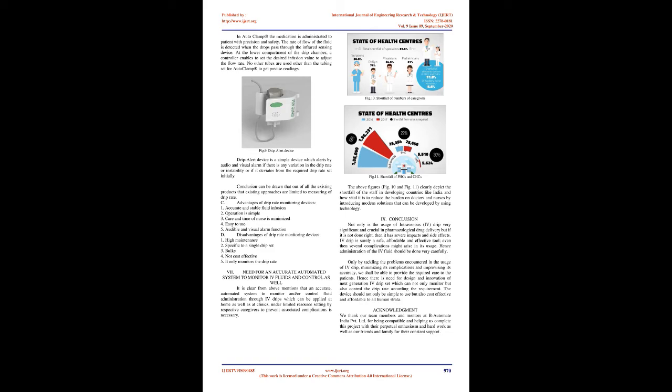Attempts made to overcome the drawbacks. Attempts were made to overcome the challenges with adaptation of drips. A few are discussed below. The traditional method of infusion was replaced by using embedded system technology, a system for detecting the variations in light transmission between a LED and a photodiode placed around the drip chamber to monitor drops. This system was designed to run with a battery, but it does not have a regulator to save battery power.